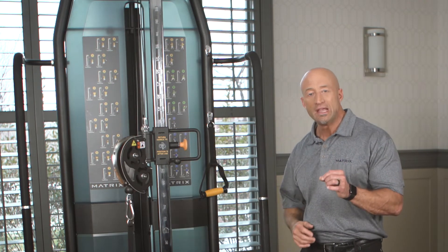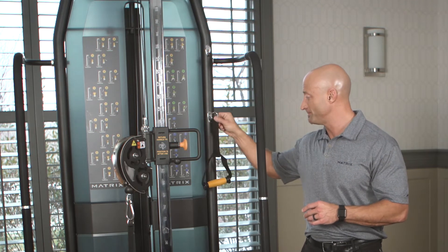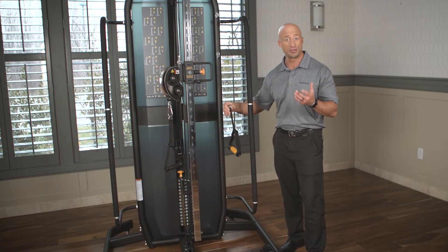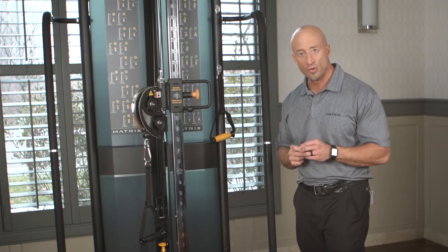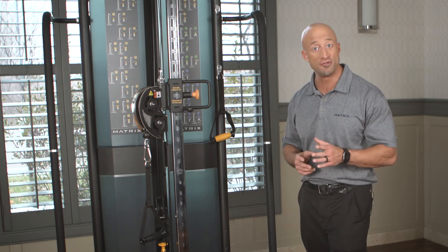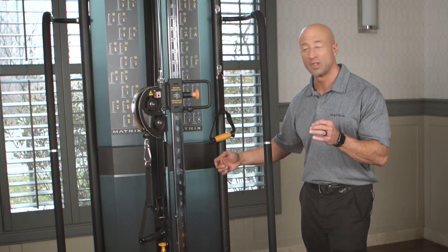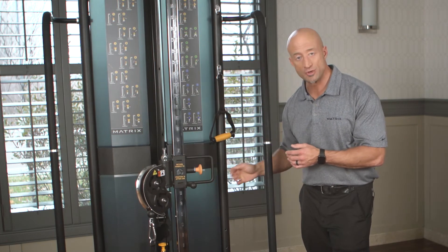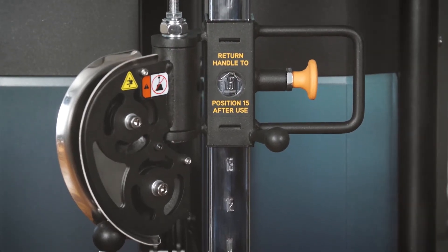There's even an inclusive fitness initiative package that we offer that allows for clearly identified markings for people that might have visual impairment or physical impairment. One of those details is a home function on the adjustable tube. At position 15, there's a picture of a home. The handle is returned to this position at the end of use for users that might end up using the product from a wheelchair.